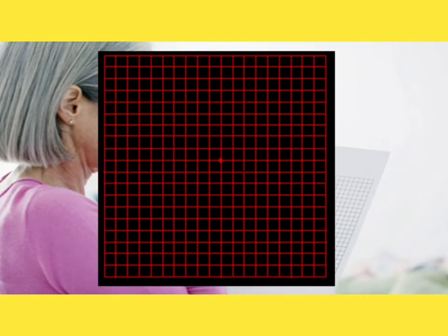Okay, now let's move to this one, where you can see the red lines over the black background. As we all know, red has a longer wavelength, so if there is any deficiency of colors, or any type of optic neuropathy or optic neuritis, then you can give the patient this chart, as due to that longer wavelength the patient can perceive the lines clearly and can inform you whether there is any abnormality or distortion of the lines. The procedure is the same, the principle is the same; depending on when it is necessary to use these charts, several types of chart are made.